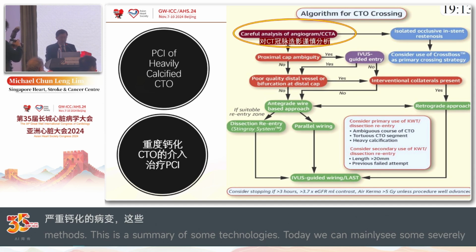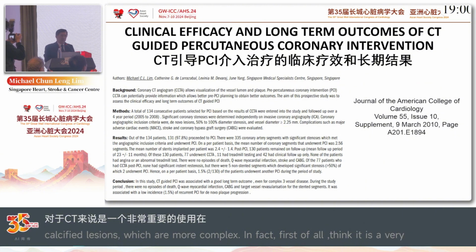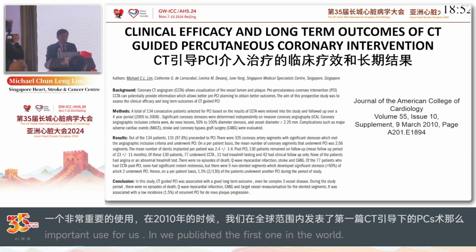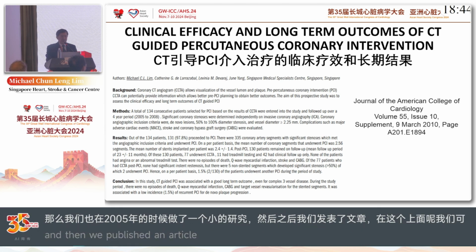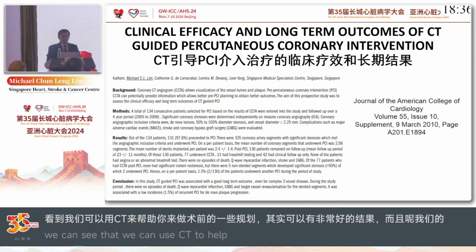So firstly, we always believe that you need to analyze your angiogram carefully. For myself, I've always believed in using CT. So in 2010, I think we published the first paper in the world on CT-guided PCI, and this was actually, we did a small study in the year 2005, and then we published it subsequently, and it shows that if you use CT to help you in planning your complex procedures, you actually get a very good outcome and with very low risk of side complications, and also more importantly, you get good long-term outcomes.